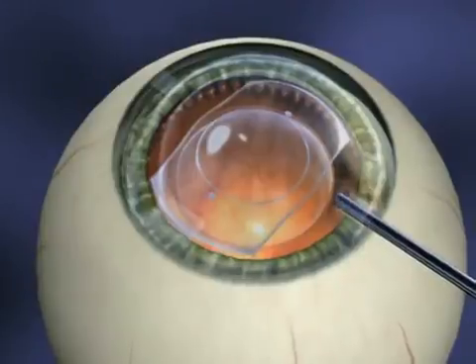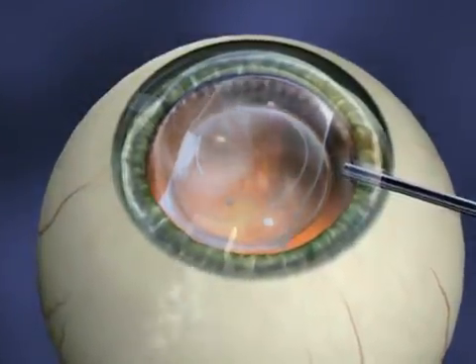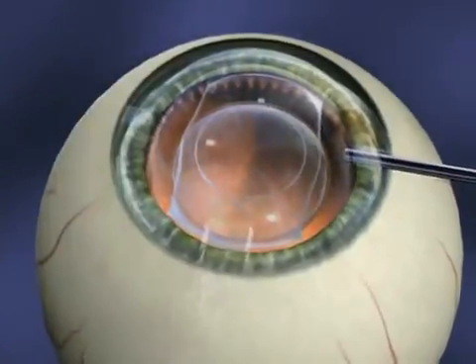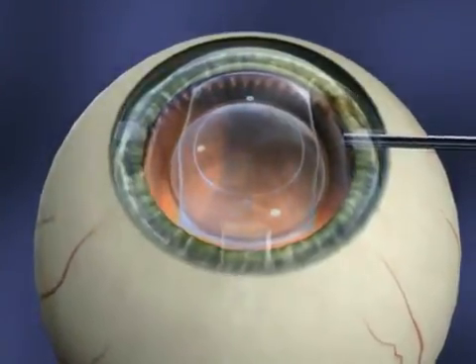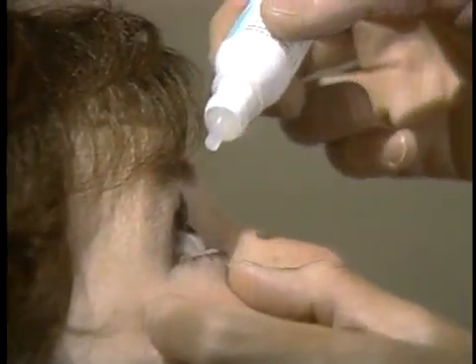Once the lens is in place, your surgeon will remove the gel-like substance. To complete the procedure, the surgeon will instill eye drops which help prevent infection and inflammation.